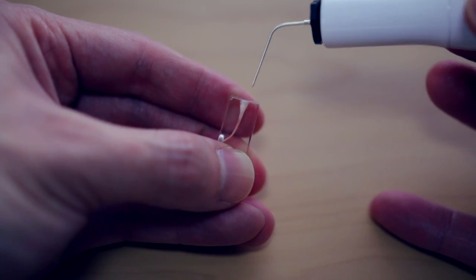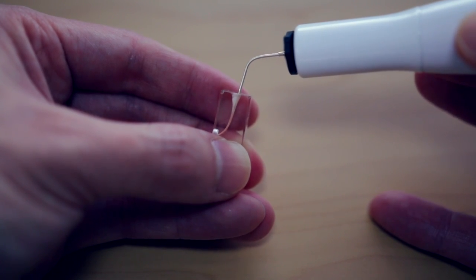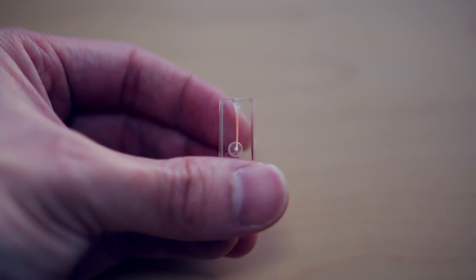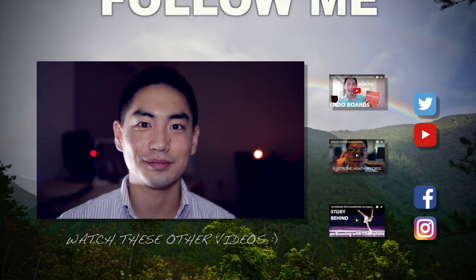Once you pack, you bring the tip in and let it heat for a second on top of your sear-off. Once heated, you extrude the gutta-percha and allow it to push back. What I like about the obturation device is that the gutta-percha comes out in a steady, mechanized manner, so you don't have to squeeze anything and risk losing control and causing voids. Once you finish, you would typically use a plugger to pack it down, and you'll have a nice result.